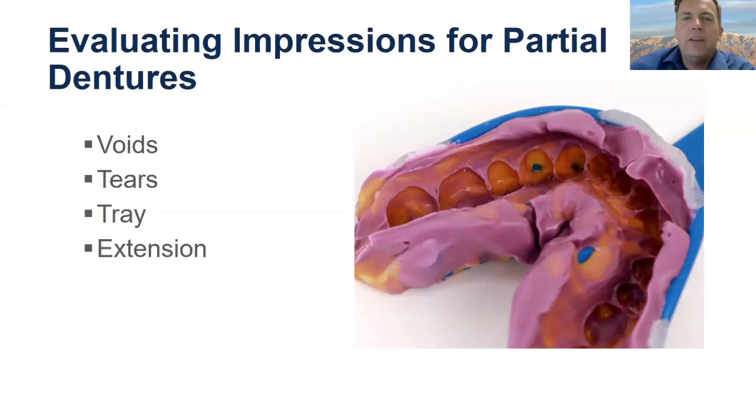It says, do you still recommend taking an altered cast impression for any free end saddles during metal frame try-on for removable partial dentures? I don't like altered cast impressions myself. The theory of it, I think, is good, but it becomes difficult to execute. And if the partial isn't perfectly seated on the model when the altered cast is poured, now I've all of a sudden changed the relationship between the tissue and the rest of the model.